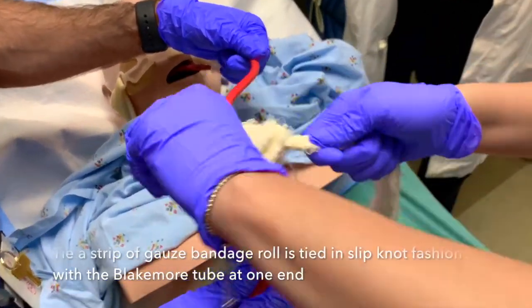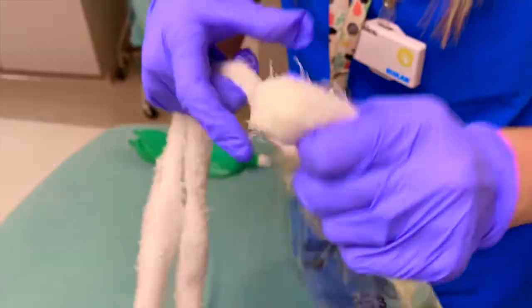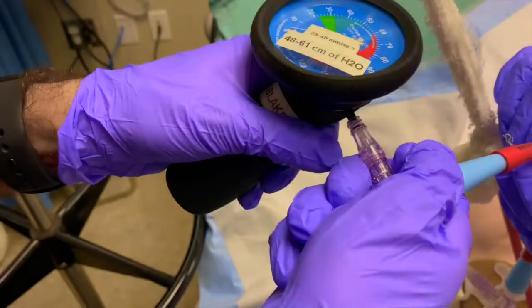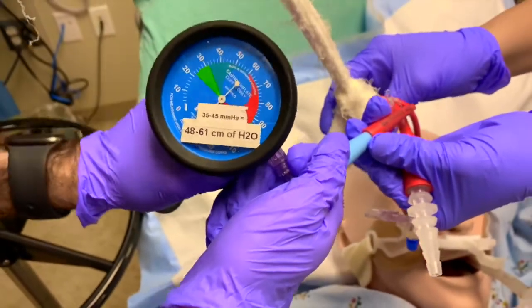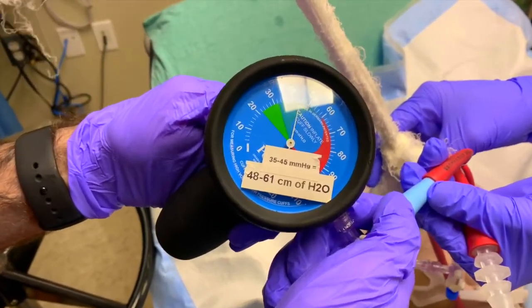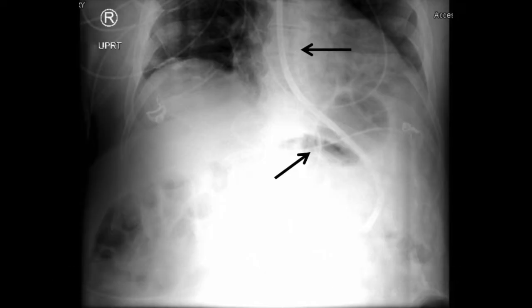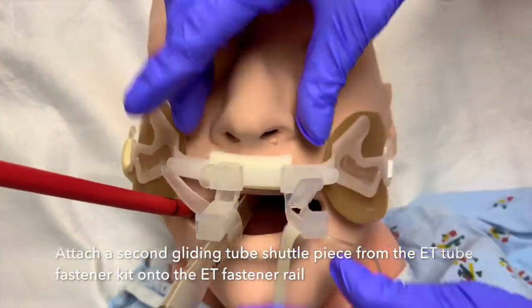A strip of gauze bandage roll is tied in slipknot fashion with the Blakemore tube at one end, and at the other end a 500cc to 1 liter fluid bag. The fluid bag is hung over an IV pole to maintain traction. Attach a cufflator endotracheal tube inflator and manometer to the esophageal port via the neutral displacement connector. Squeeze the pump until you reach a marking between 48 to 61 cm of water. This marking may be between 35 to 45 mm of mercury on some manometers.